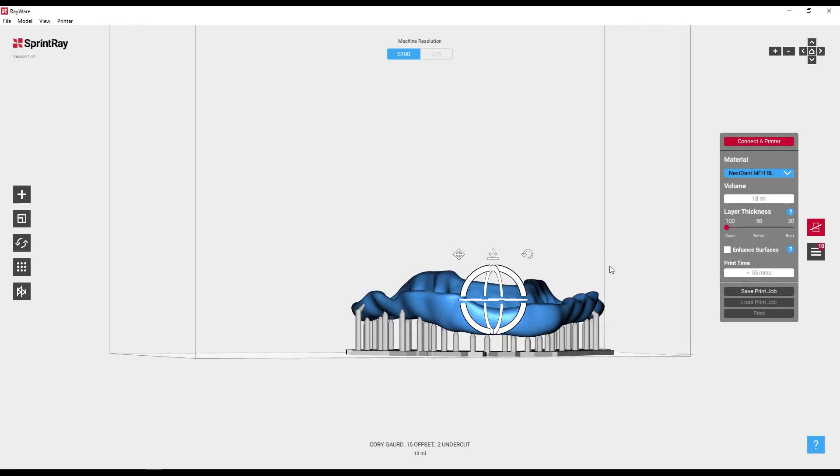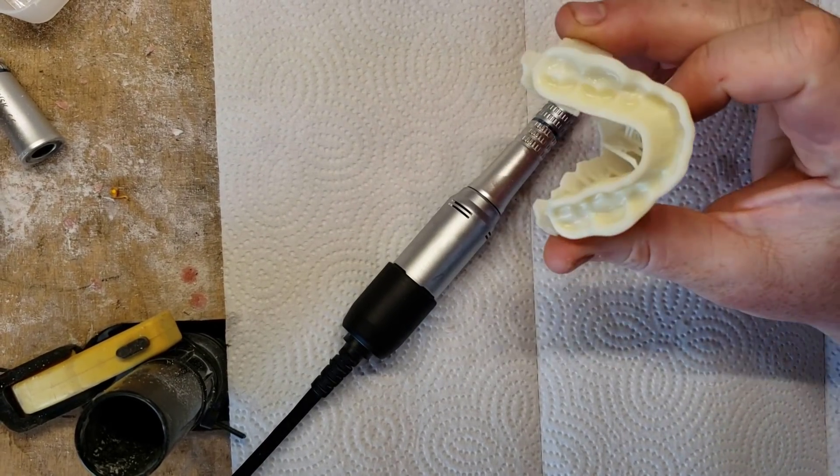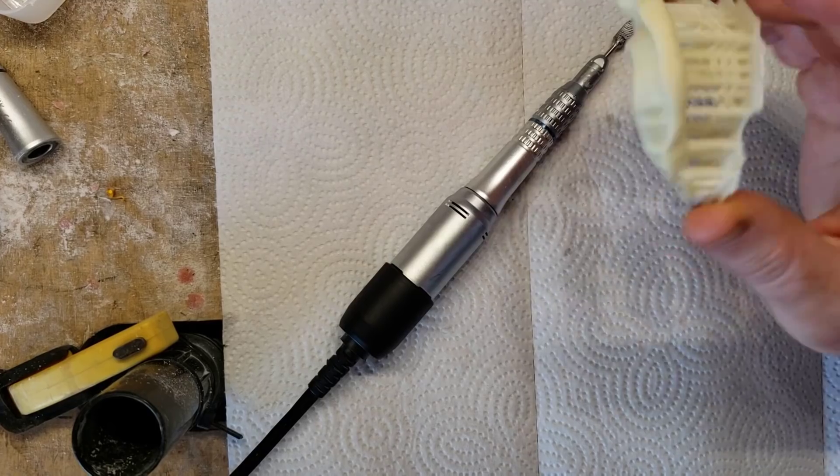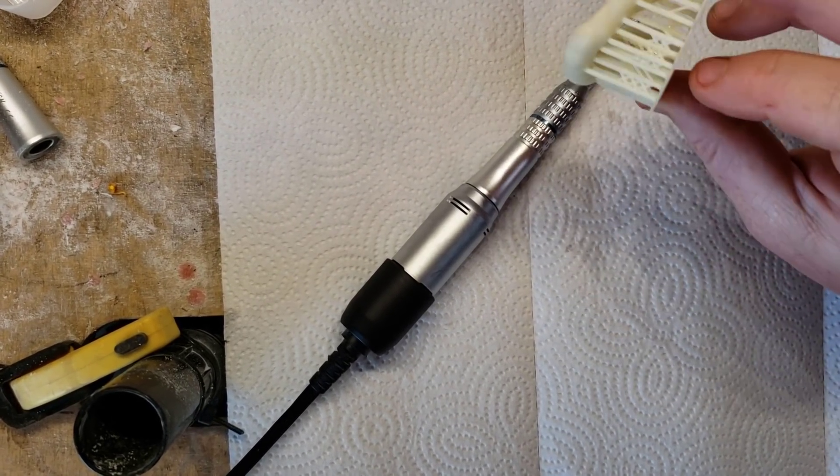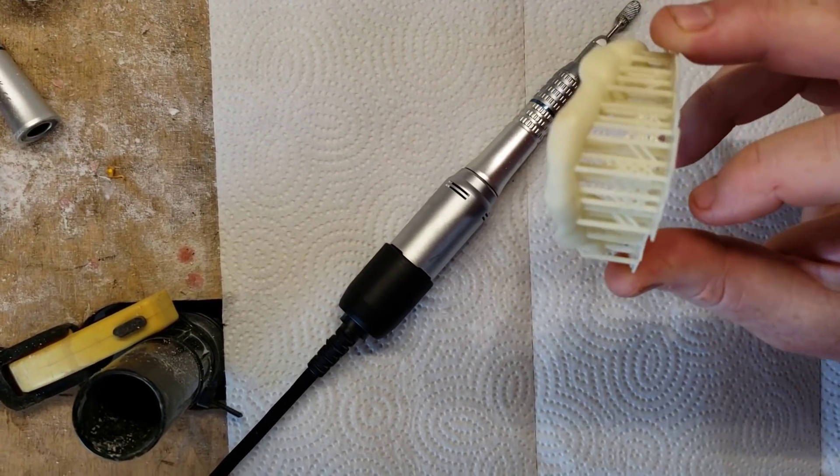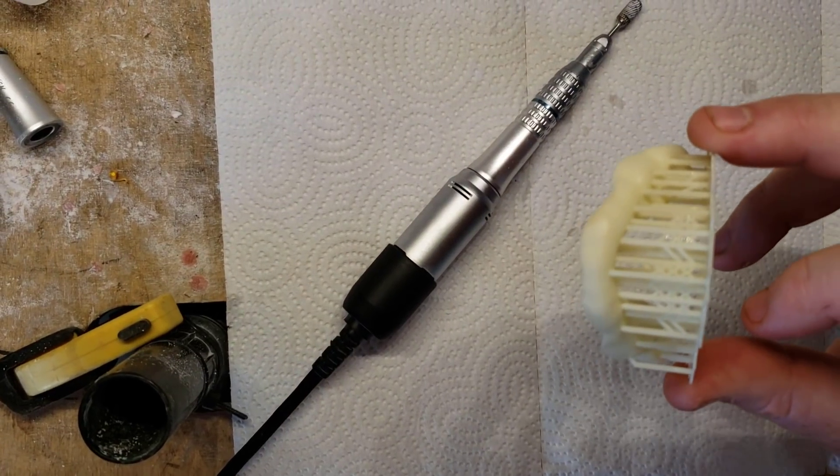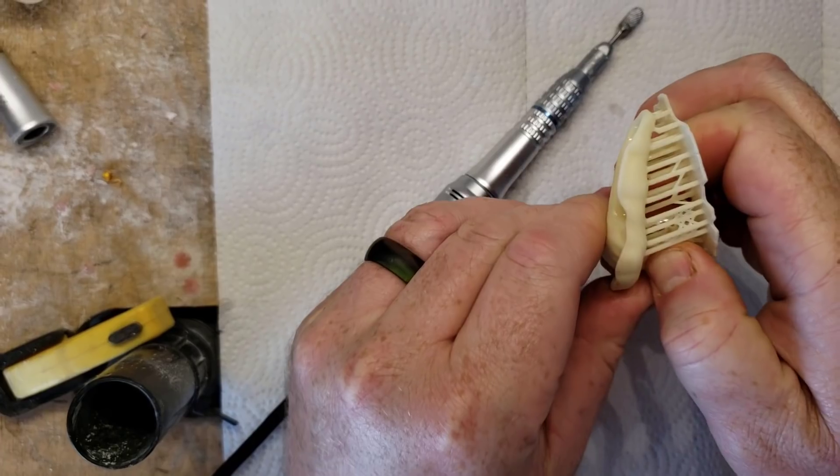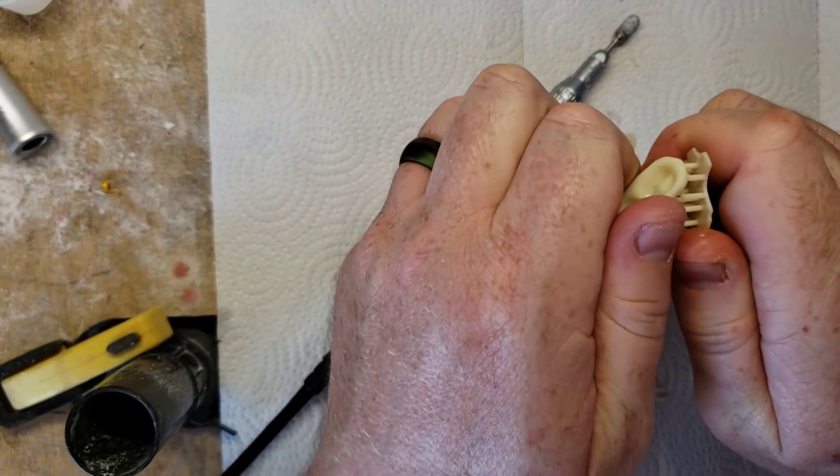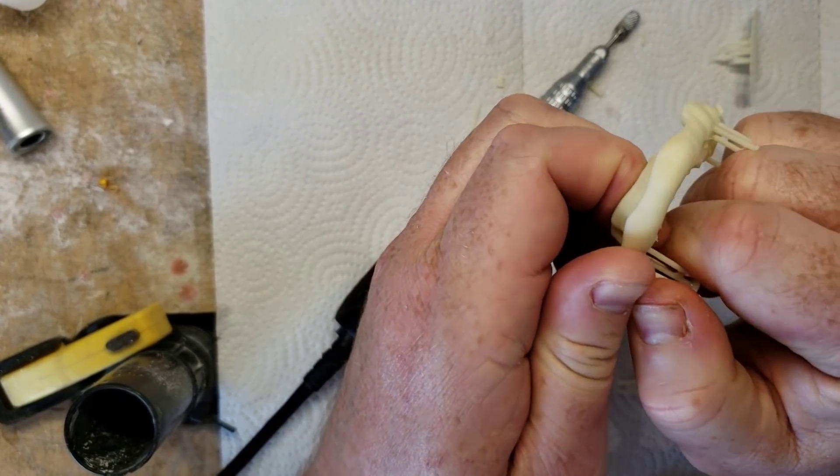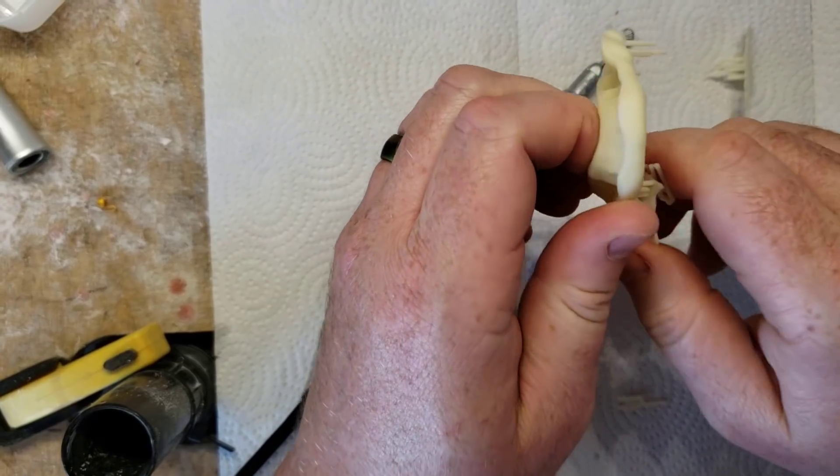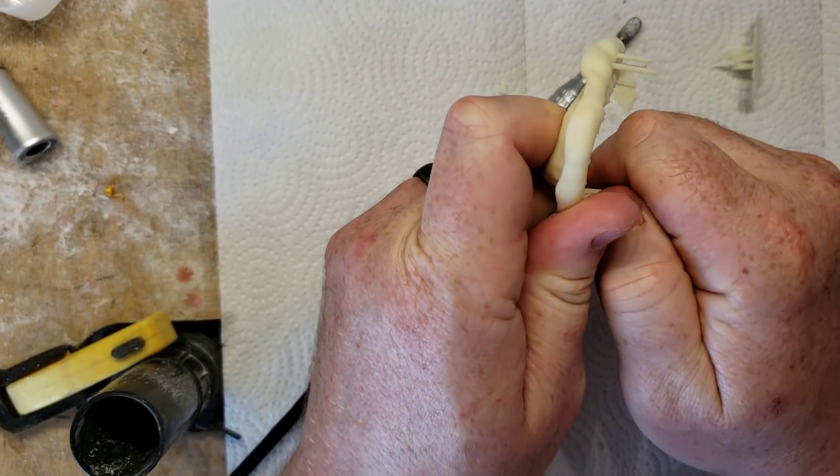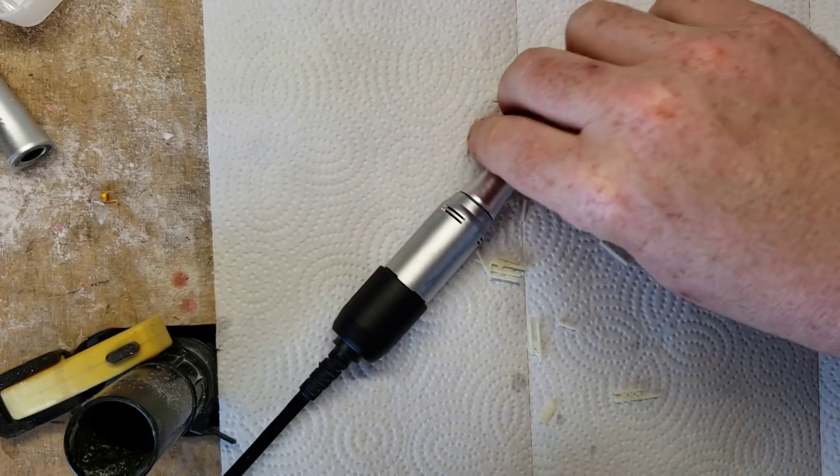What would you print this out of? You could use the night guard resin or the NextDent MFH material because that's good for long-term use in the mouth. At a hundred micron thickness, this is going to take 55 minutes to print. I'm going to cut now to actually trying this in. Here we have the 3D printed guard straight out of the printer. I did the alcohol rinse, put it in the curing oven. I've still got it on the support so you know I'm not pulling any tricks.